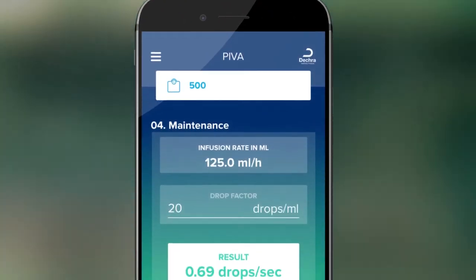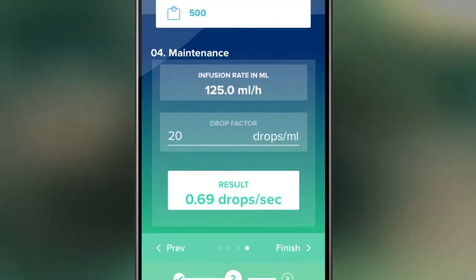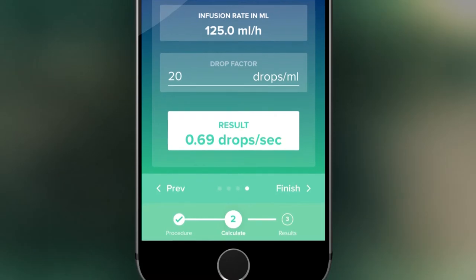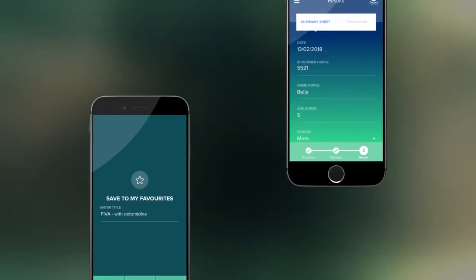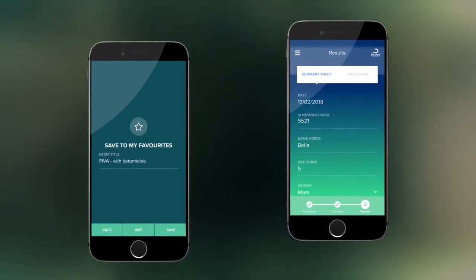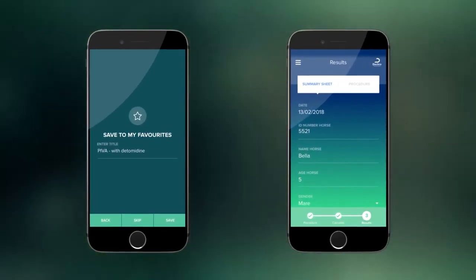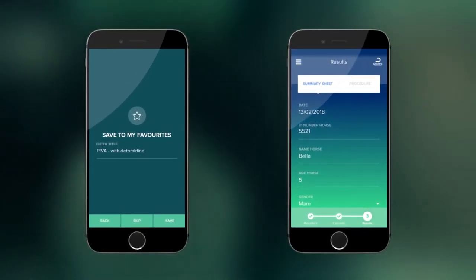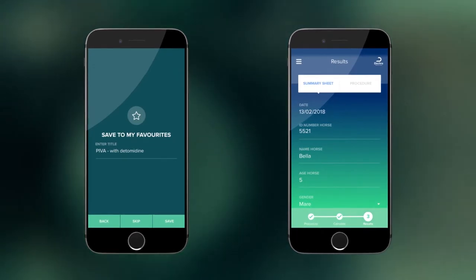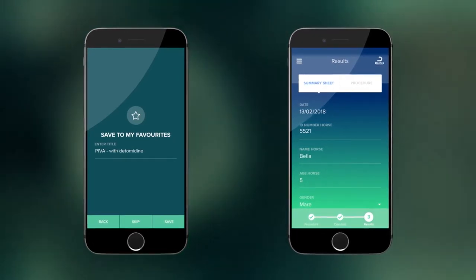You will then see a summary of the entire procedure displayed on the app. The procedure can be saved as a favorite protocol into the My Favorites folder within the app in case you would like to use it again.